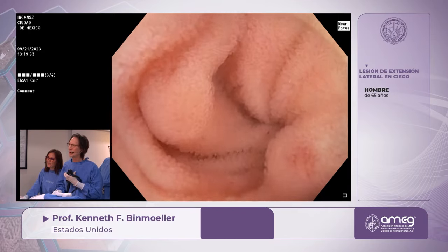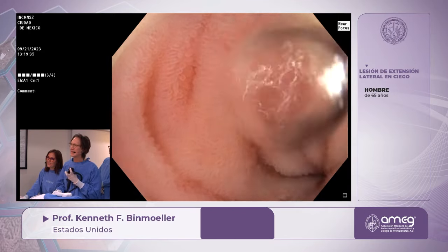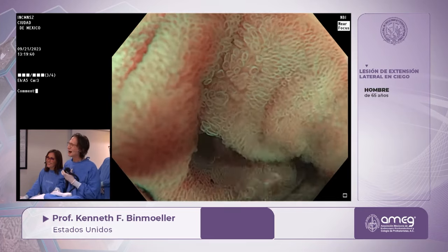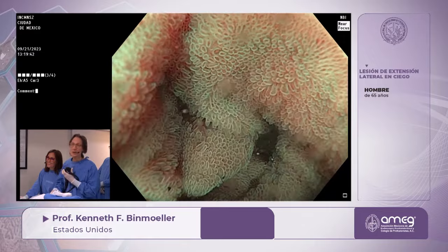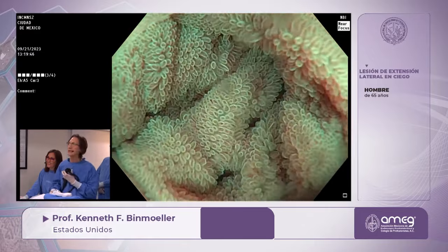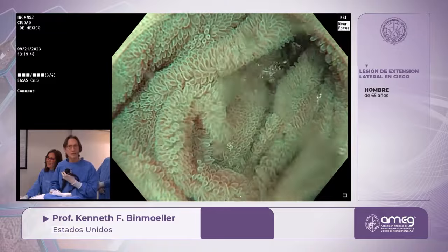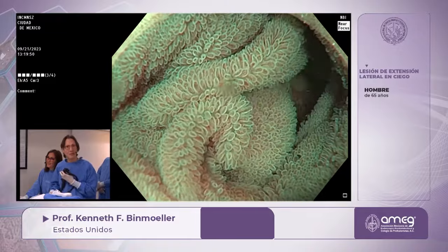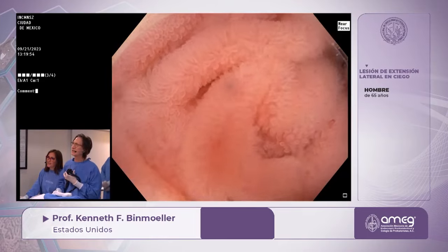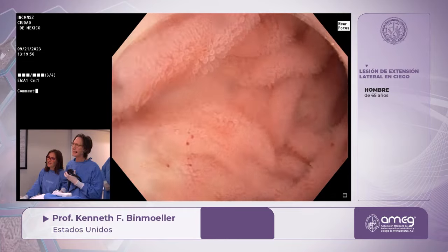And it looks all very normal. You can see the beautiful villi. You can put on NBI if you want a nicer view. So it looks all very beautiful. And underwater, you can go surprisingly very high up into the ileum. So this is how I do my deep enteroscopy from below, underwater only, like this. All right, let's take off the NBI, coming back.